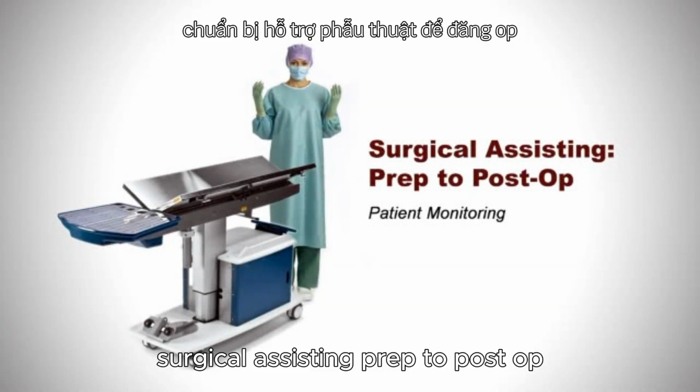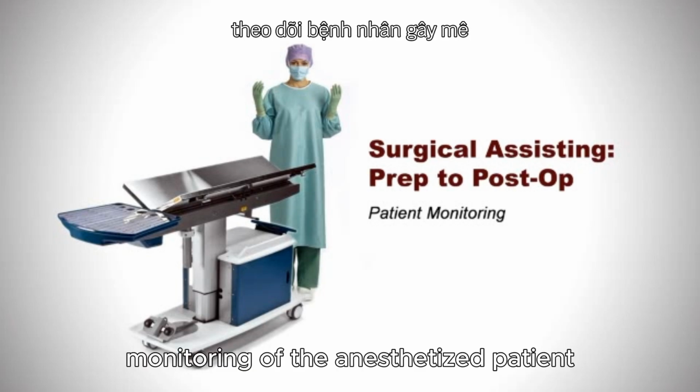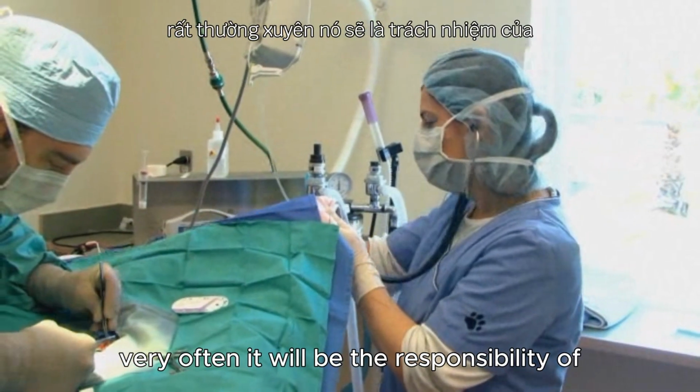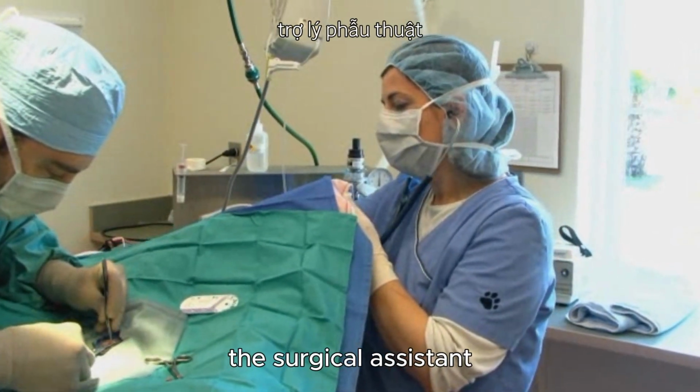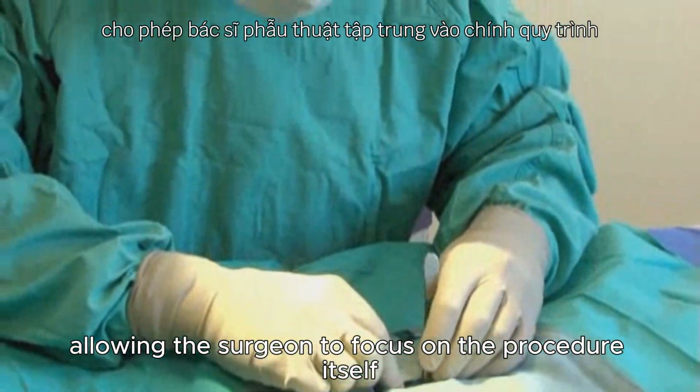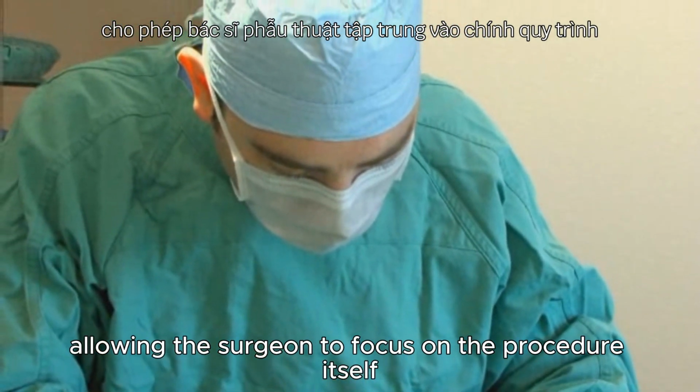Surgical assisting, prep to post-op, monitoring of the anesthetized patient. Very often, it will be the responsibility of the surgical assistant to monitor the patient during surgery, allowing the surgeon to focus on the procedure itself.